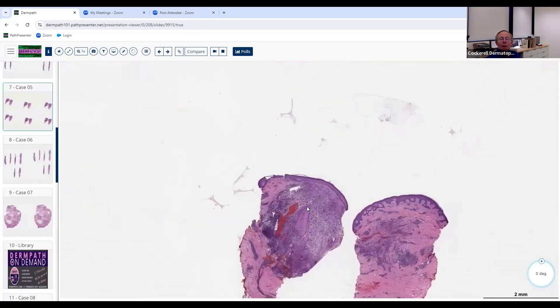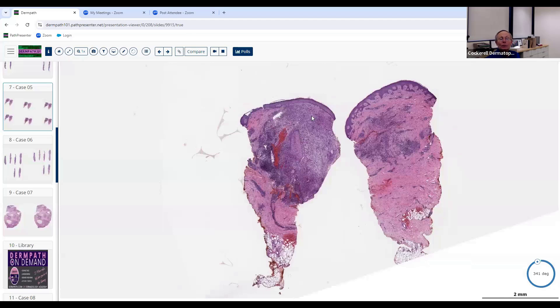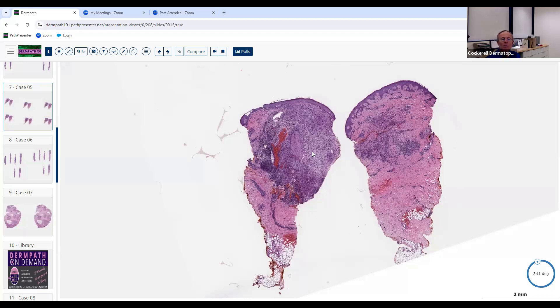Here's another punch biopsy with an inflammatory condition. At low magnification it's a really dense diffuse pattern. As opposed to the mastocytoma or eruptive xanthoma we saw earlier, you can see right away there are a lot of lymphocytes — black dots at low magnification — but there's also a pallor over here. When we see pale cells, we think about deposits, lipid, mucin, or pale histiocytes. Dense diffuse infiltrates bring up a different clinical scenario: sarcoid gives diffuse histiocytes, Sweet's gives diffuse neutrophils. It's not going to be a drug eruption or urticaria.